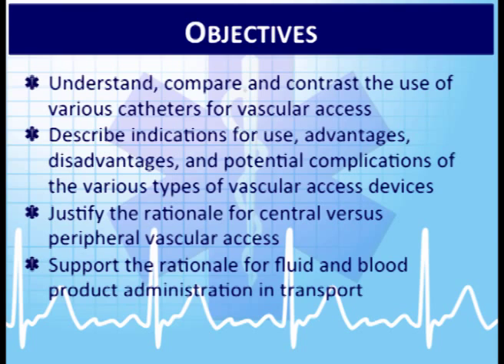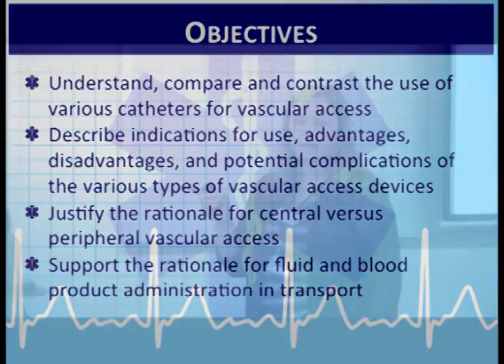The complications are interesting. Sometimes they'll say, well, they get put in the hospital, what do we care? Well, they don't stay overnight after a central line insertion. If they go home and they have an air embolism, if they have a thrombus, as critical care paramedics, we need to know those signs and symptoms. So when they tell us, hey, I had the central line put in today, I'm really short of breath, the patient's diaphoretic, tachycardic, we can put those two things together that, okay, they just had this procedure done, we need to start thinking that maybe they have an air embolism or a thrombus, something going on, or is it totally separate from that procedure?